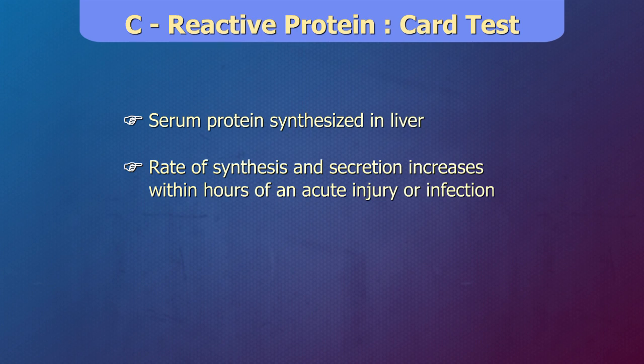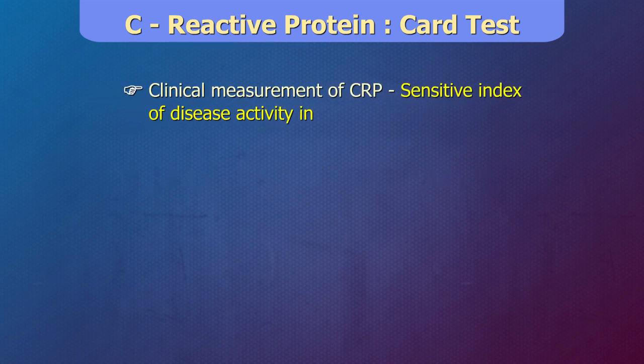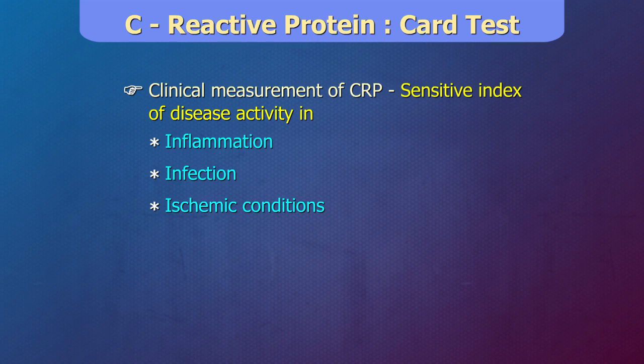Normally, it is present only in trace amounts in serum, but it can increase as much as 1,000-fold in response to injury or infection. The clinical measurement of CRP in serum, therefore, is a sensitive index of disease activity in inflammatory, infective, and ischemic conditions.